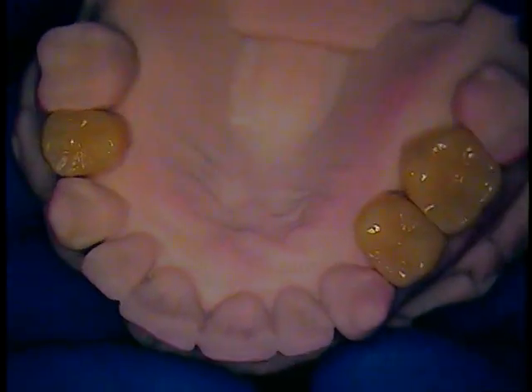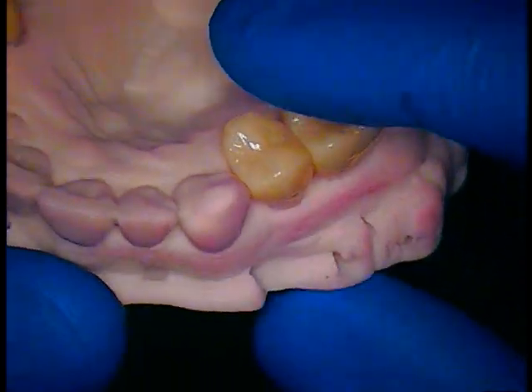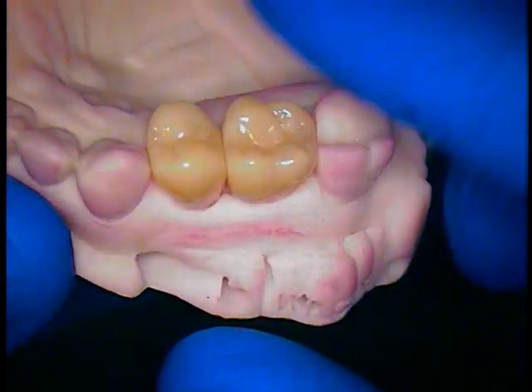We're back. This is Dr. Jerry Cuomo. I'm here in my Boca Raton office. It's all about cementation today — we're going to cement these crowns into place. First and foremost, the upper right side.